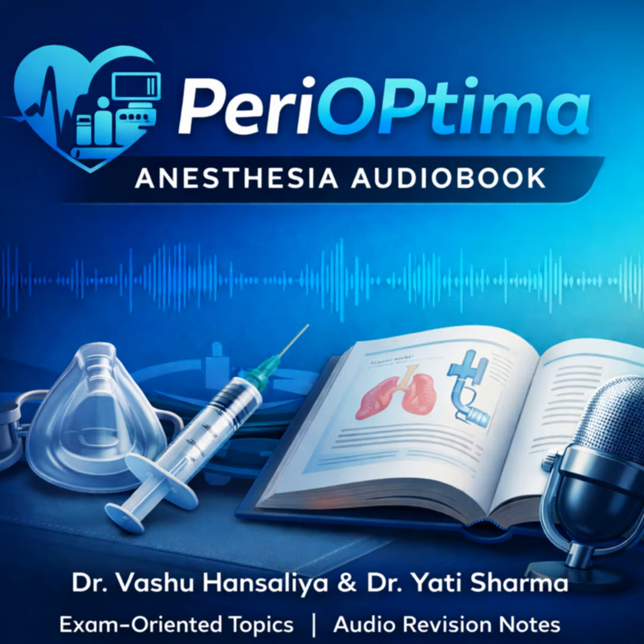Okay, preparation is complete. Let's walk through the mechanics. The technique of fiberoptic intubation. We can start with the stepwise oral fiberoptic intubation. Step 1 is preparation. The ETT is preloaded onto the lubricated FOB. You insert an oral airway, like an Ovassapian, to keep the mouth open and guide the scope midline.